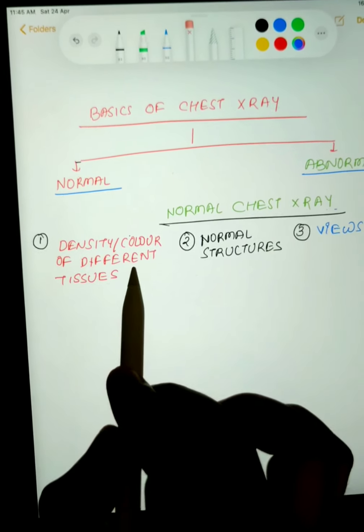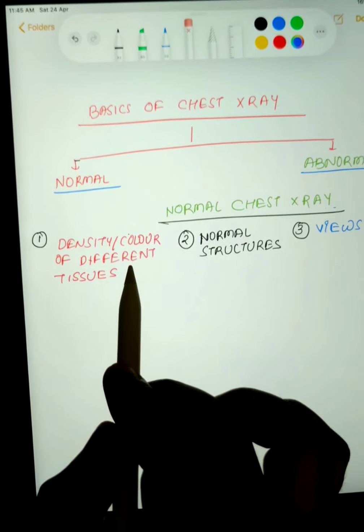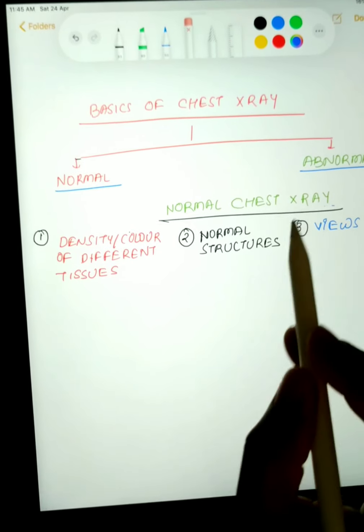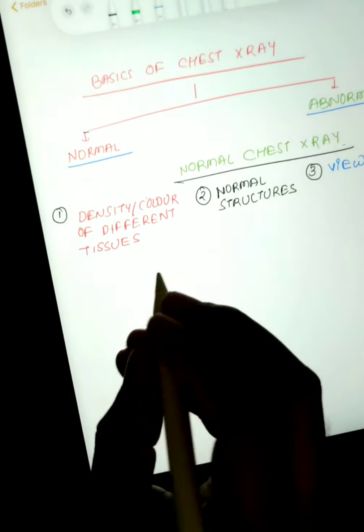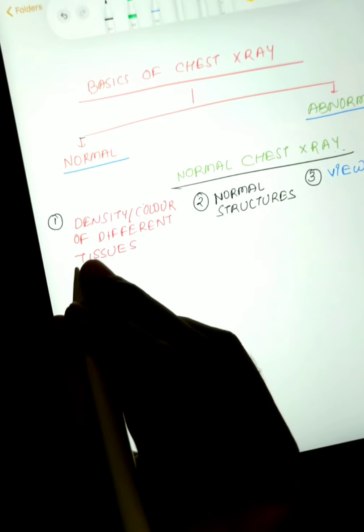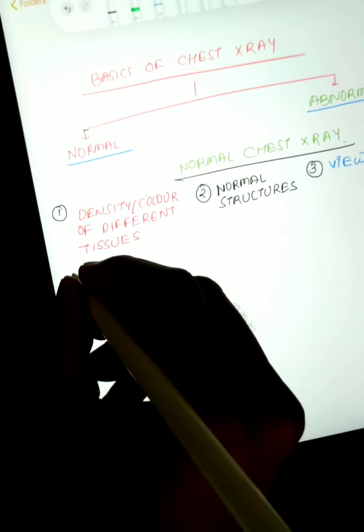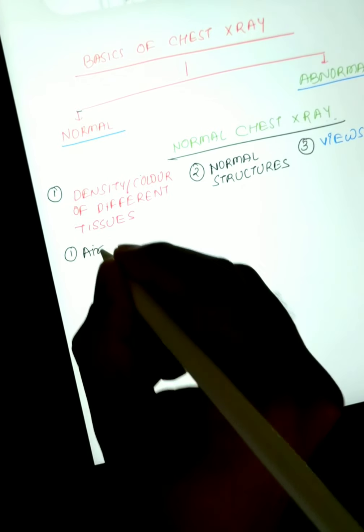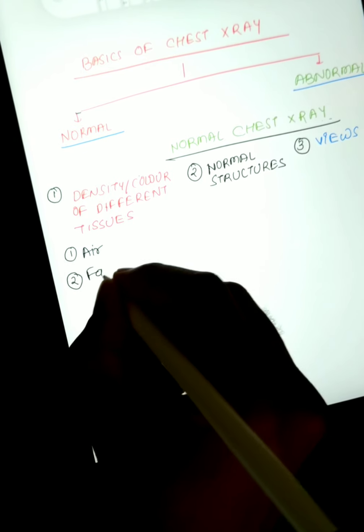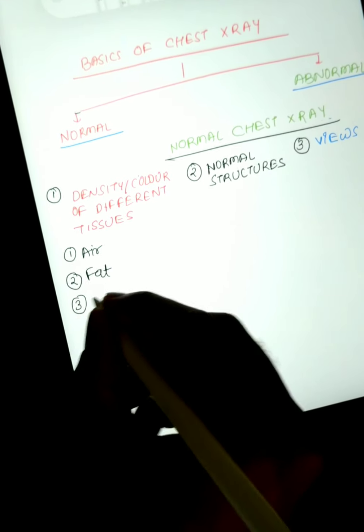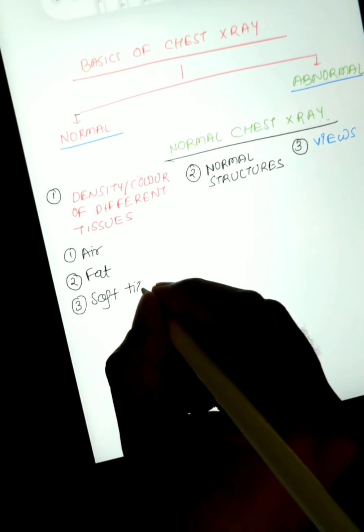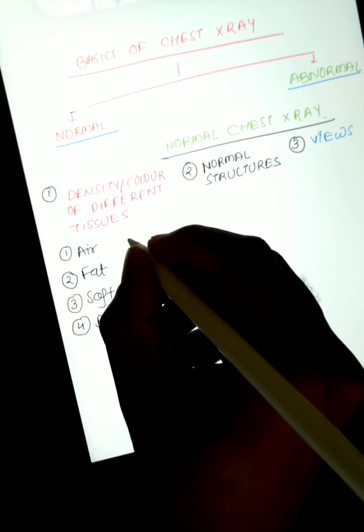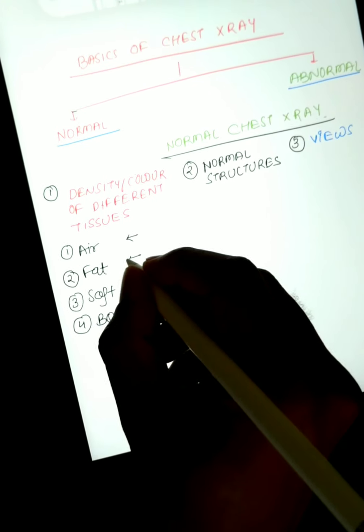In a normal chest X-ray, we will look at three things: first, the density or color of different tissues. There are four densities on a normal chest X-ray — first is air density, second is fat, third is soft tissue, and fourth is bone.